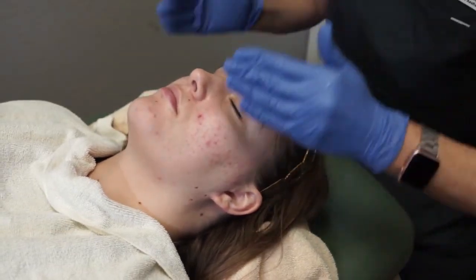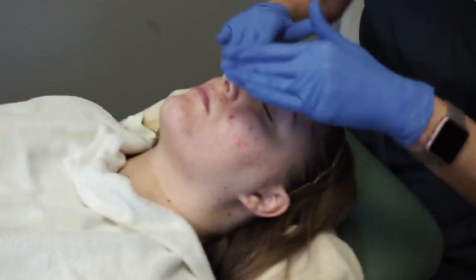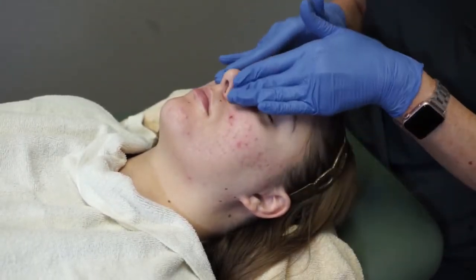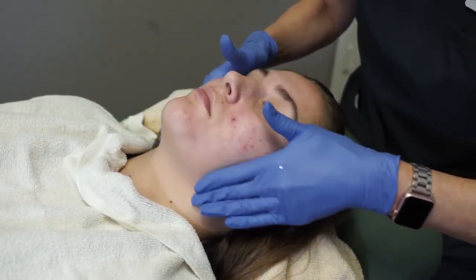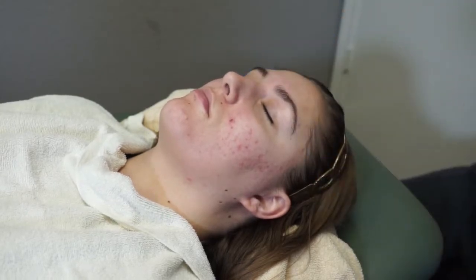A thin layer of Lift should be applied to the intended treatment area. Be careful not to apply too thick a layer, as this could clog the cartridge. If you are new to microneedling, consider applying Lift to each section to be treated to accommodate a slower treatment time and to keep the product from drying out.